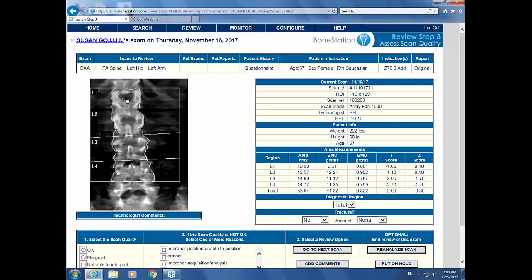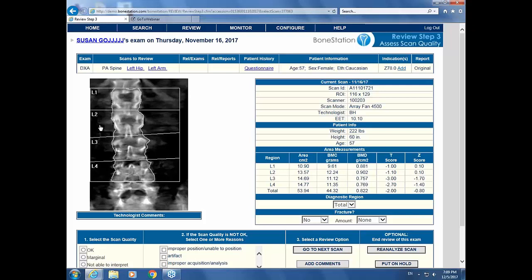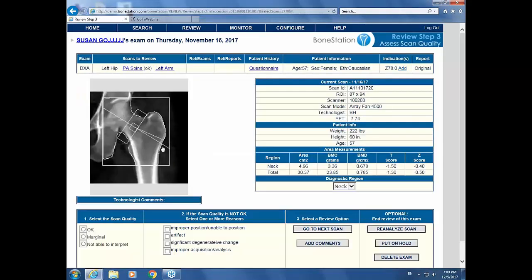ISCD guidelines are that we report the spine and the hip, and we report the forearm if the patient has hyperparathyroidism or if there is some limitation to the spine or the hip. In this case, the technologist correctly recognized sclerotic changes in the spine and acquired a wrist. On the hip, the femoral neck box is nicely up against the greater trochanter, the femoral midline is correctly placed, and very little of the lesser trochanter is seen. I'm happy with the technical adequacy.